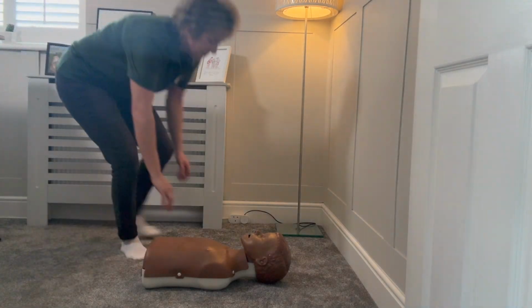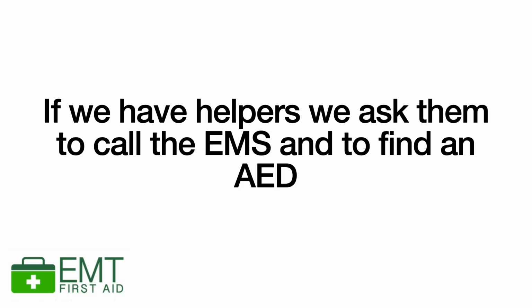Can you hear me? Can you hear me? Wake up. As soon as the casualty does not respond to us, we ask our helpers to call the emergency medical services and go and get an AED. And in this example, we're going to assume we've got helpers there and they're going to go and find us an AED and they'll bring it back to us.